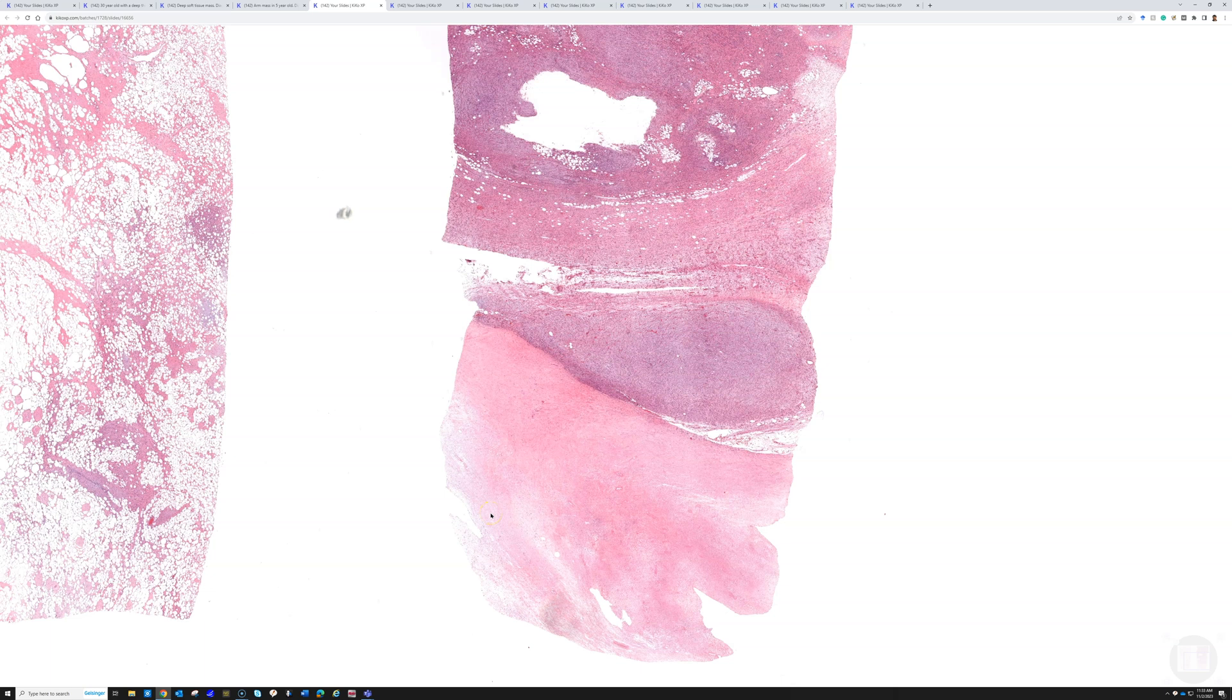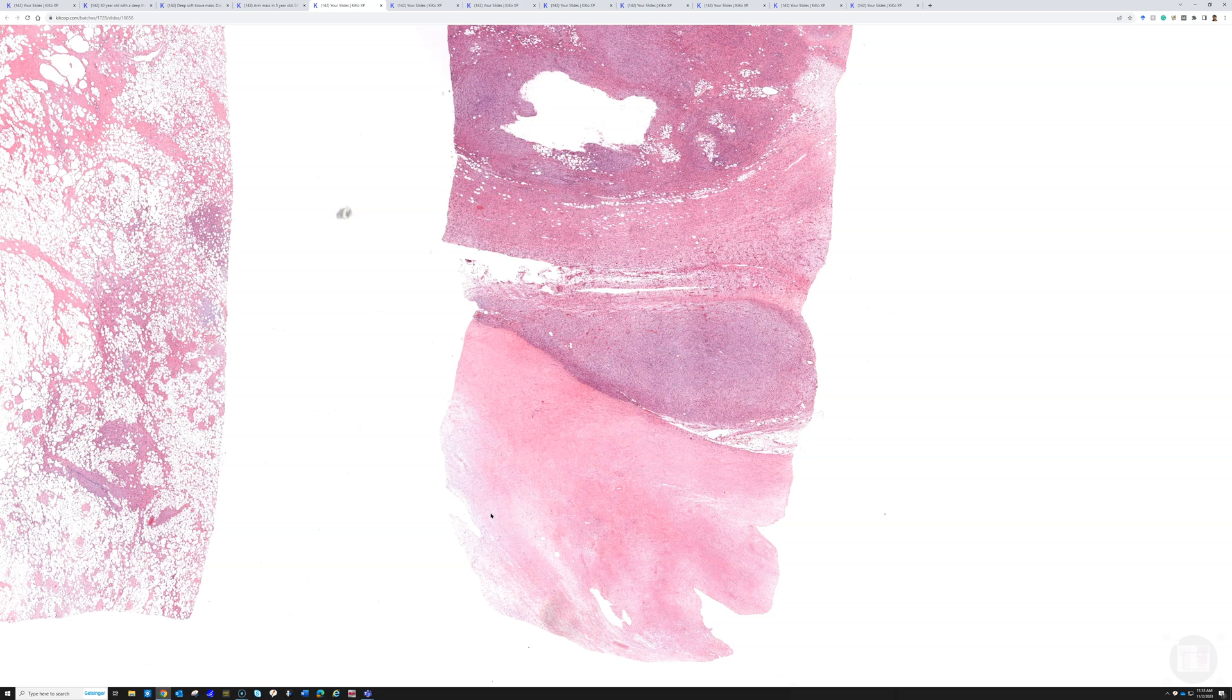A hypercellular spindle cell tumor with some necrosis, and we're in the retroperitoneum of an adult. The first, second, and third thing on my differential diagnosis is going to be de-differentiated liposarcoma. A high-grade sarcoma in the retroperitoneum of an adult is de-differentiated liposarcoma until proven otherwise. De-differentiated liposarcomas are relatively common as sarcomas go in adults in the retroperitoneum.